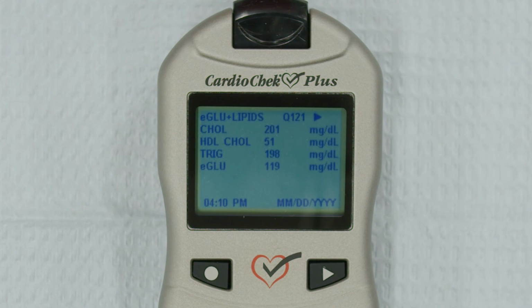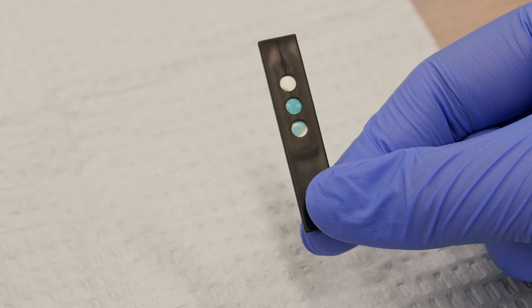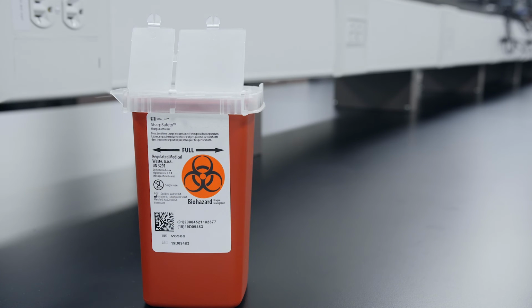Once the results are displayed, remove the test strips. Check the back of the lipid panel test strip to make sure that the 3 circles are completely colored. This indicates that you applied enough blood sample to obtain accurate results. If the circles are not completely colored, you may need to collect another sample and run the test again with new test strips. Once the test is complete, record the results and dispose of the test strips in a biohazard container.